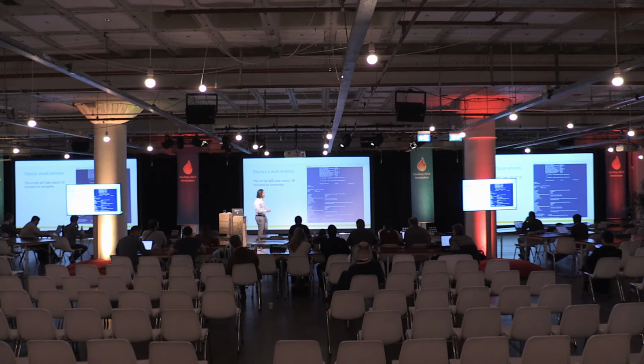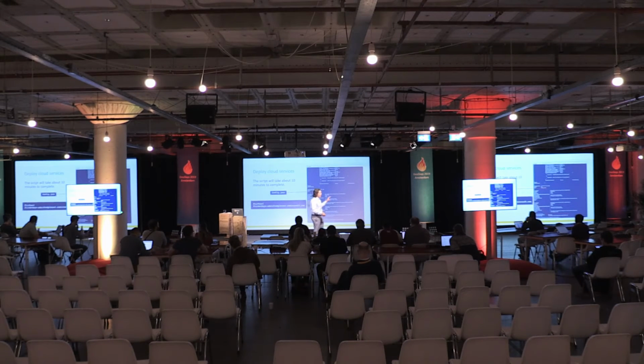So this script is going to take about 10 minutes to complete, and it's going to output 2 things. So number one, it's going to generate a config.json file. Later on, we're going to use this to set up the iOS application. We're just going to drag it right onto the simulator screen. It's going to point the simulator to this cloud environment that you set up. And then, like I said before, it's going to print out a username and the password that you used. You can use my password, that's fine, FHIRPass1. And that you're going to use to log into the sample app.